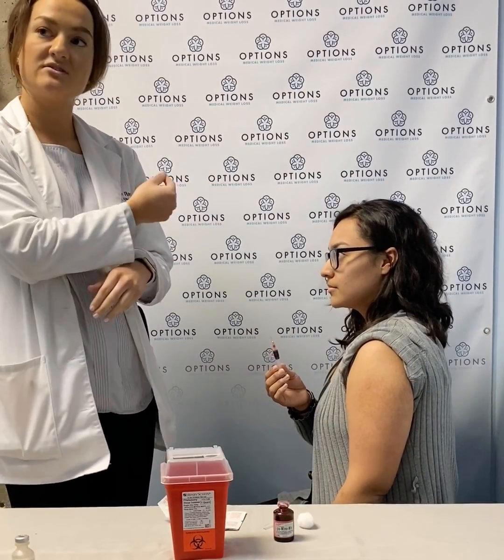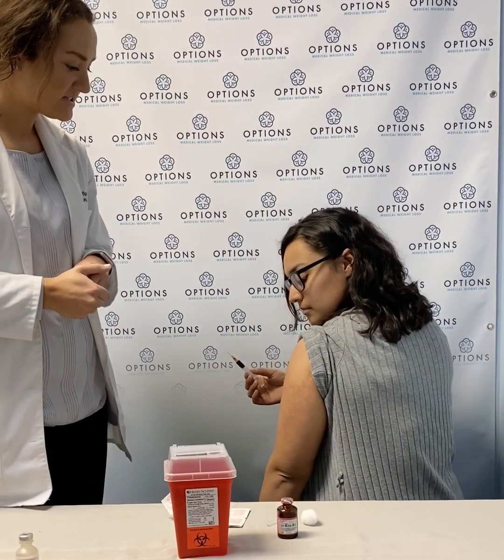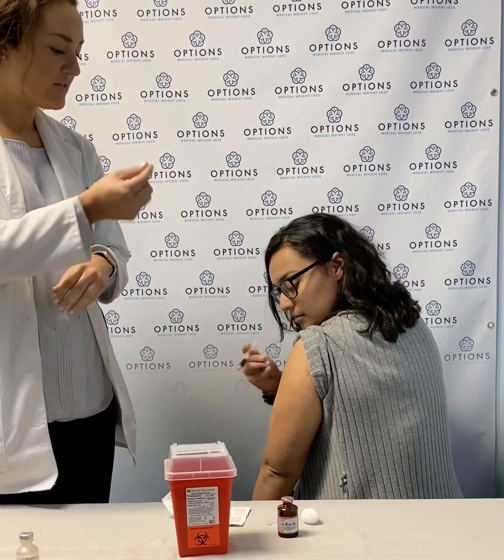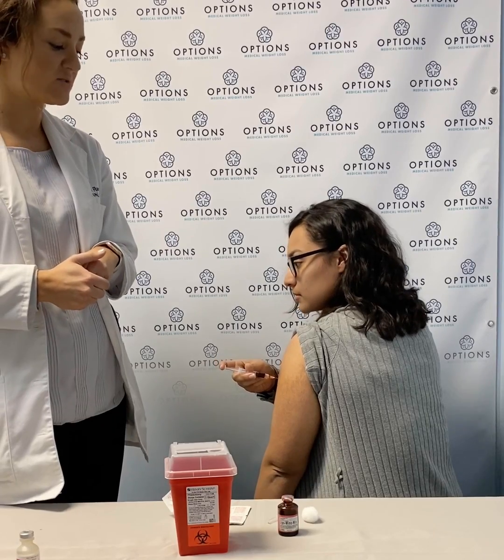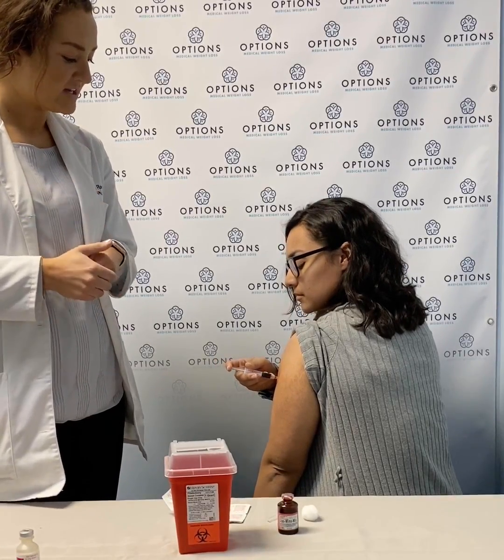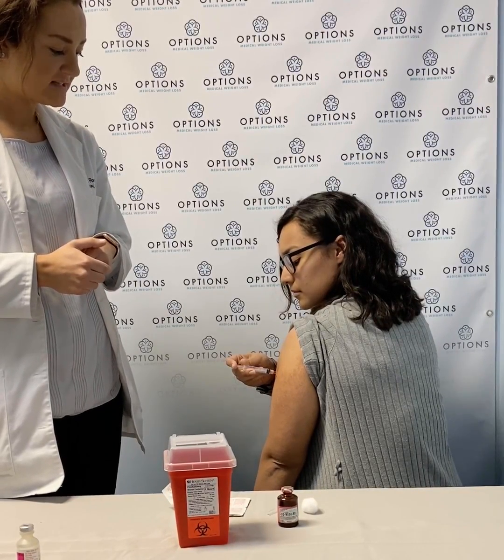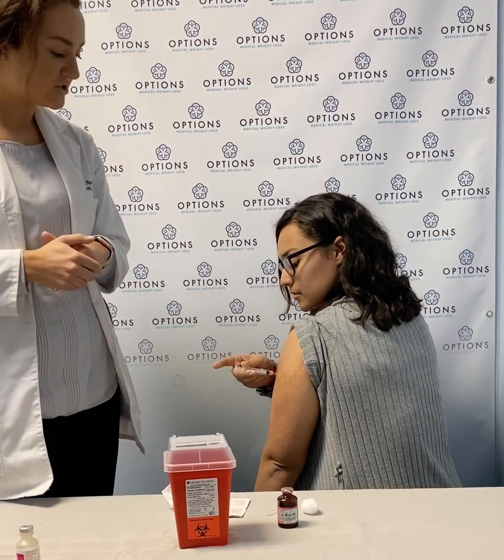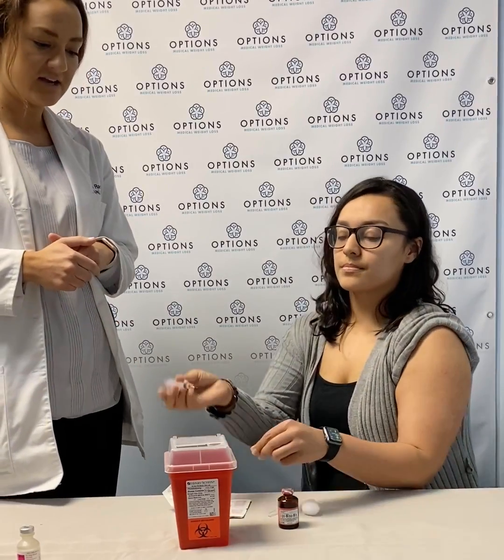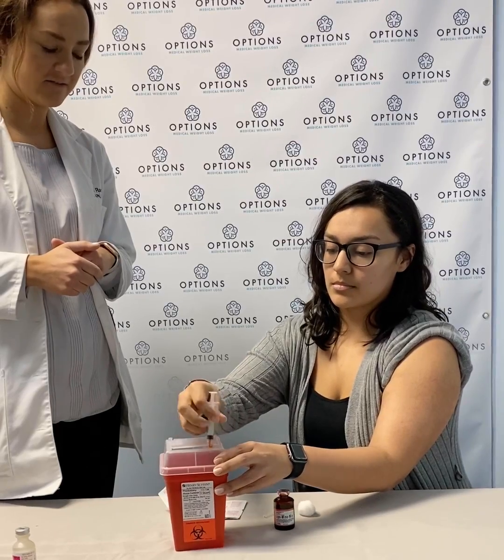For this, we do want to go in at a 90 degree angle to the skin. So you are going to turn to your side here, and you will go directly in at 90 degrees, all the way in until your skin hits the orange portion of the needle, just like that. Then you are good to inject the liquid, all the way. And then you can come out at the same 90 degree angle. You can dispose of your needle in our sharps container here, as Leslie is modeling for you.